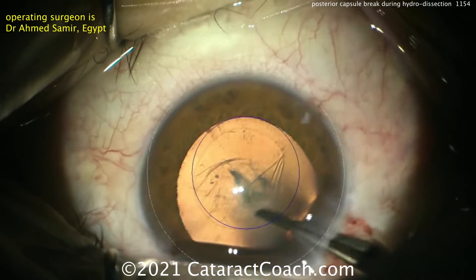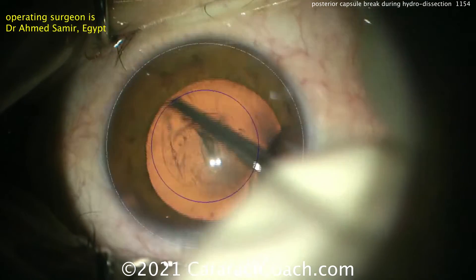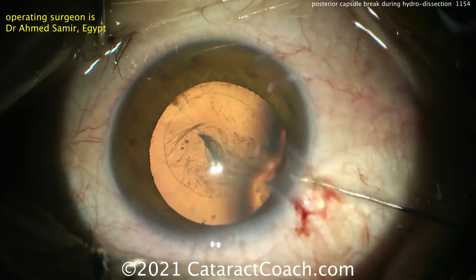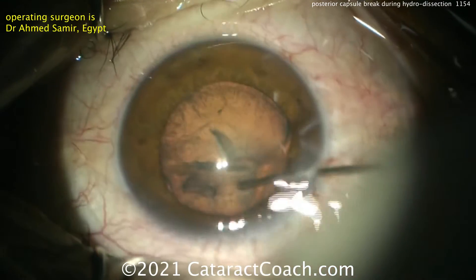Now what we're going to encounter in this case is the Capsule Block Syndrome. When you have the hydrodissection going on and that pressure wave that goes across builds up too much pressure between the posterior capsule and the lens and it doesn't have room to escape, what can happen is you can blow out the capsule.